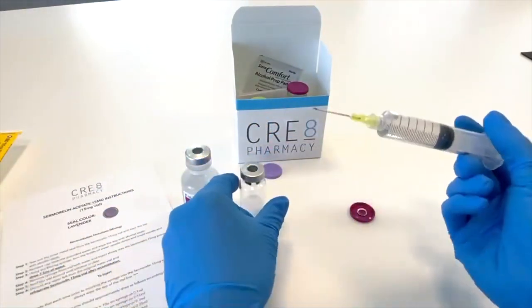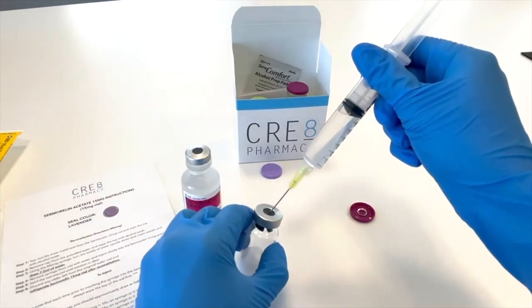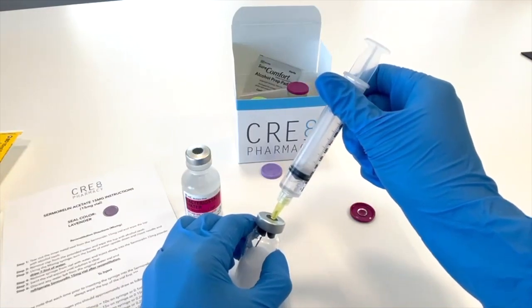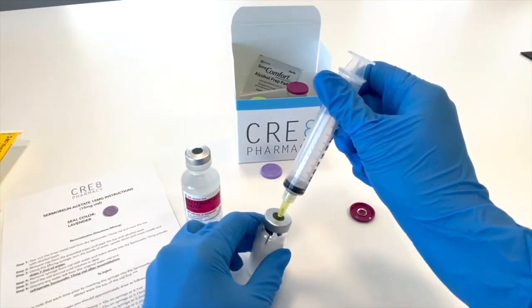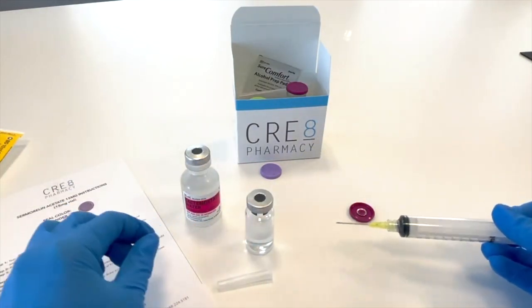The fifth step will be to insert the needle into the lyophilized powder vial. You will notice that the pressure alone will allow for the syringe to flow easily into the vial; however, some pushing may be needed.